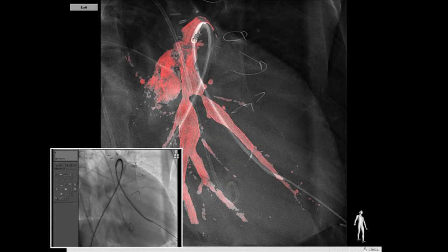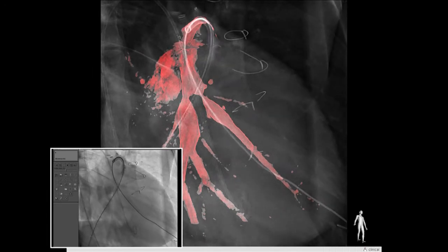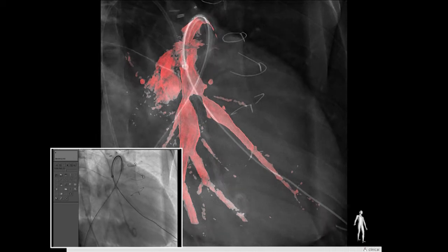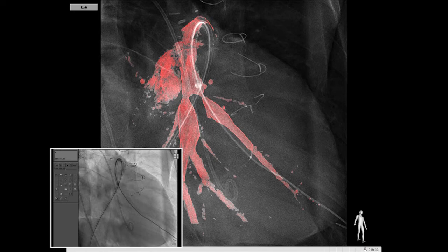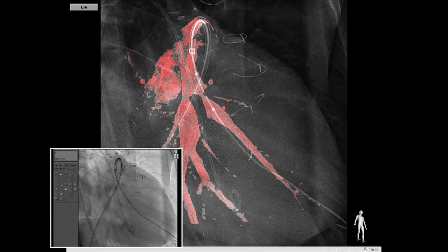We will try first with a 4mm balloon on the most stenotic vessel. Since the distal vessel was 6mm, some might say to go with a bigger balloon, but it's actually better to use a smaller balloon for more effective dilation of that smaller vessel — you probably don't need to make it to 6 anyway, since distal to that it's smaller, so 4 or 5mm may be enough. With 3D rotational, you don't do a check angio; you just confirm on your rotation. That's the advantage of this angiogram.